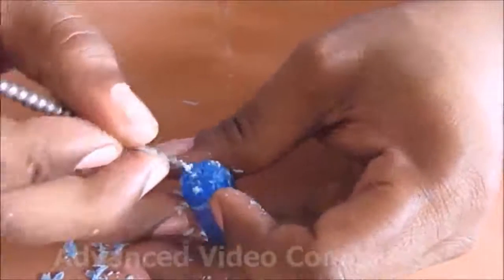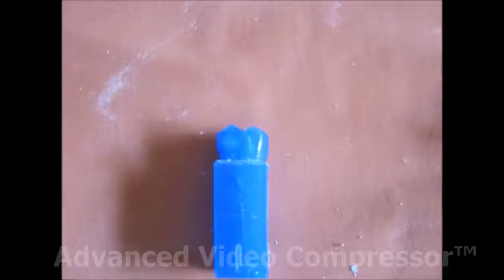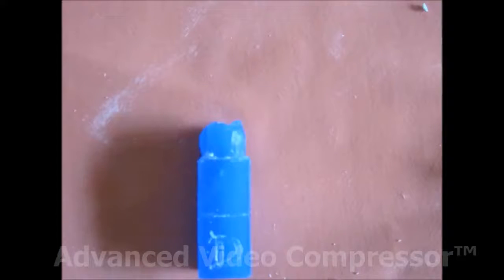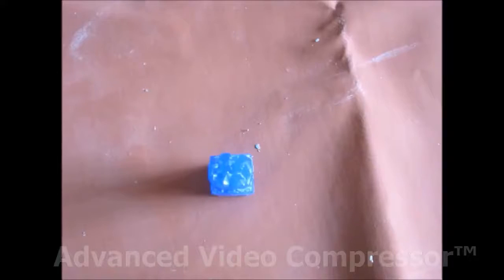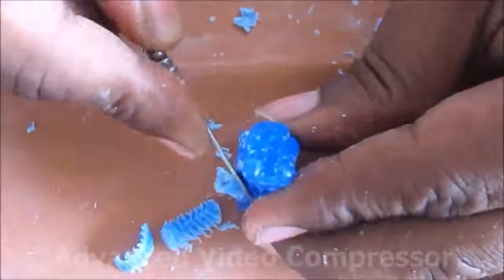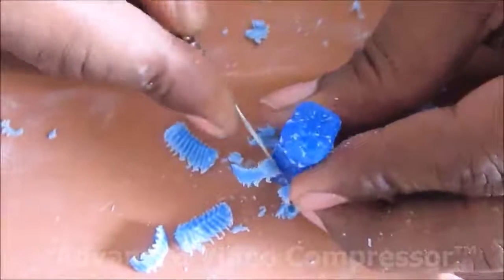This is how the tooth looks from buccal, lingual, mesial, distal, and occlusal surface. The difficult task of making the root is done best by removing the wax, with the wax block resting firmly on the Macintosh sheet.